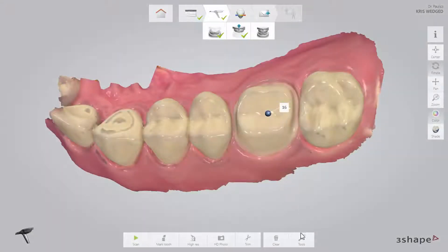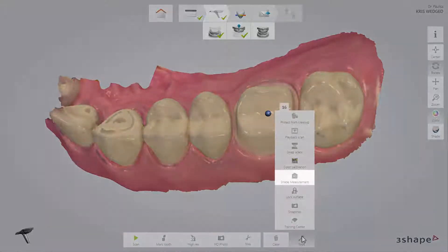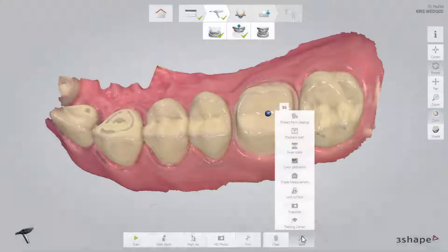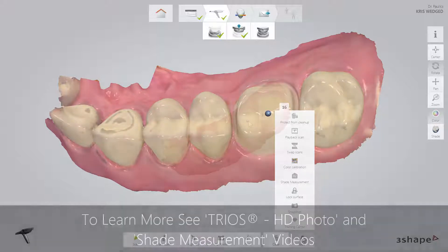Now you have the opportunity to do shade measurement and take an HD photo. Please see the TRIOS Shade Measurement and TRIOS HD Photo videos for more information. An HD photo may be useful for the lab to set the margin.